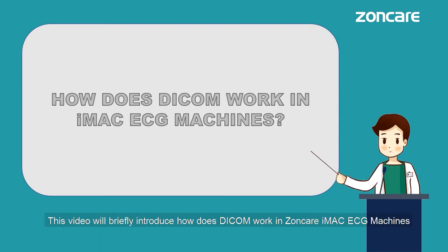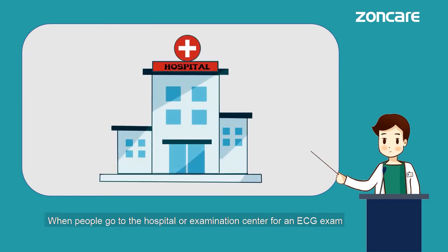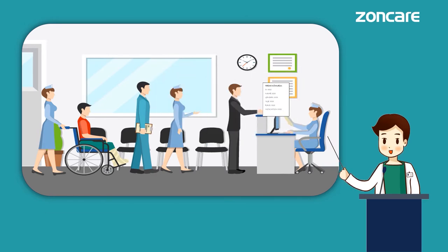This video will briefly introduce how DICOM works in Zoncare iMAC ECG machines. When people go to the hospital or examination center for an ECG exam, after they check in, patient information will be uploaded to the hospital's PACS system.